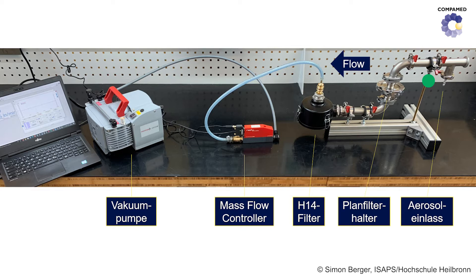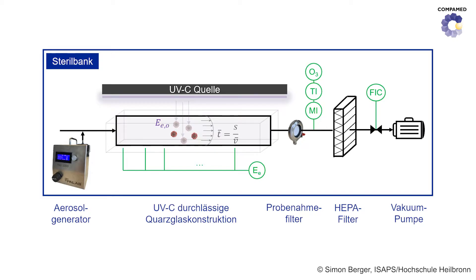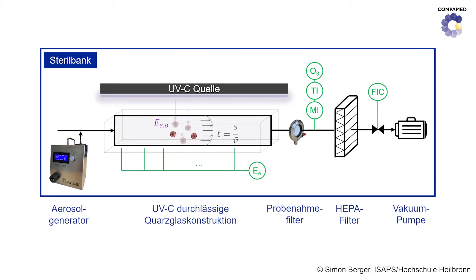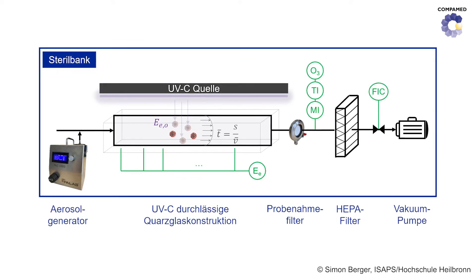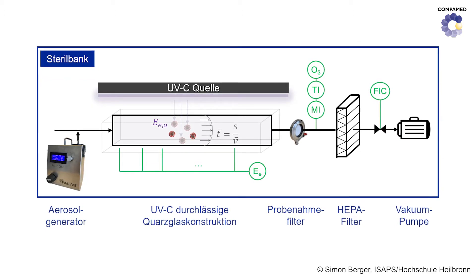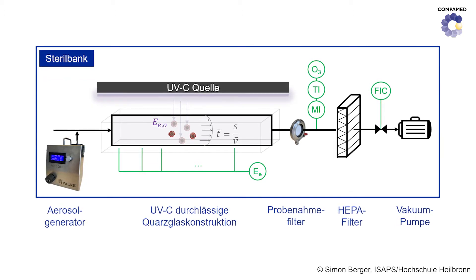Professor Niesner explains which components belong to the test rig. First of all, our test rig consists of a conduit system allowing flow-through. At the very beginning is the aerosol generator, which gently nebulizes cell culture medium containing SARS-CoV-2 viruses so that they are preserved. At the end is a vacuum pump which generates a volume flow that can be controlled. And in between is our test section, which consists of a UVC lamp and a quartz glass tube in which the aerosols flow.